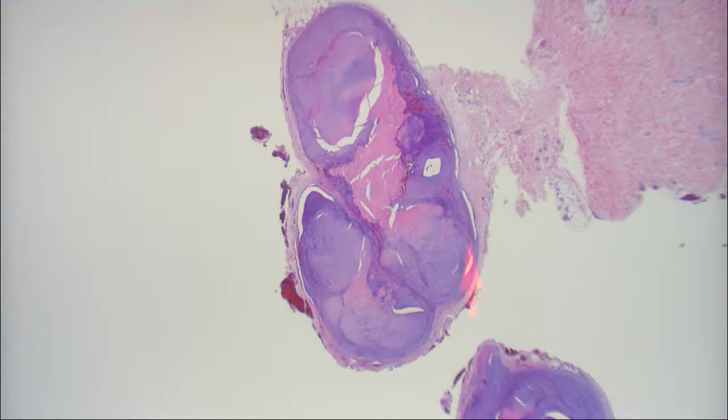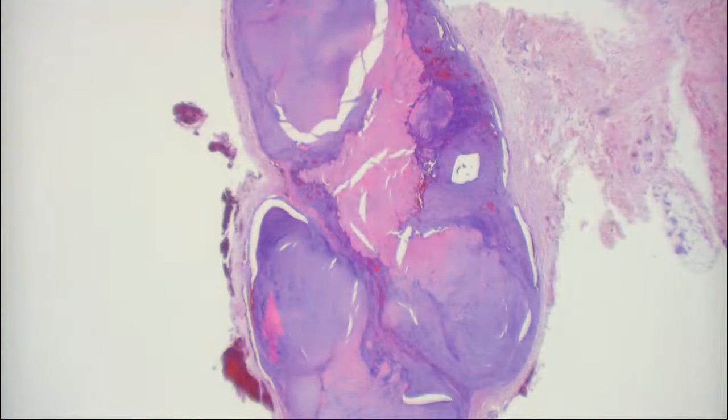It's really, really deep. So clinically, this probably would have been a very low dome process. Probably would have had to feel this. Okay. So then the question is differentiation. So it's benign. So now, what kind of differentiation are we looking at? I may have been a little off with my differentials here.